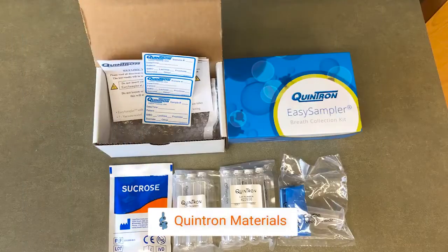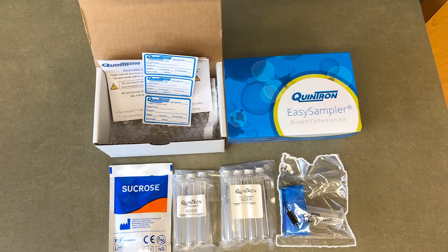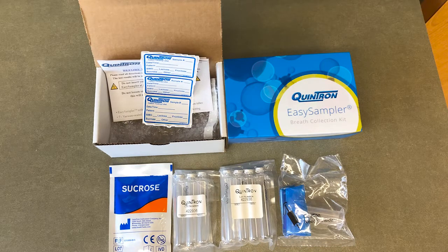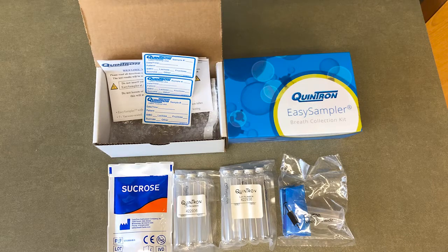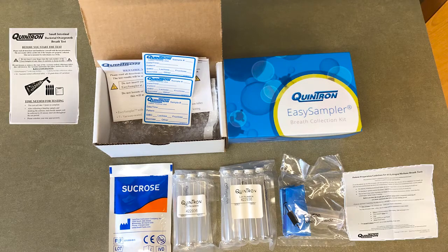Neurovana uses only Quintron-supplied collection materials, which ensures the best and most reproducible test results possible. Each Neurovana-supplied kit contains Quintron's Easy Sampler with Tube Holder, vacuum-sealed collection tubes, labels for the collection tubes, a sugar substrate, the paperwork, Neurovana instructions, intake form, and the collection instructions.